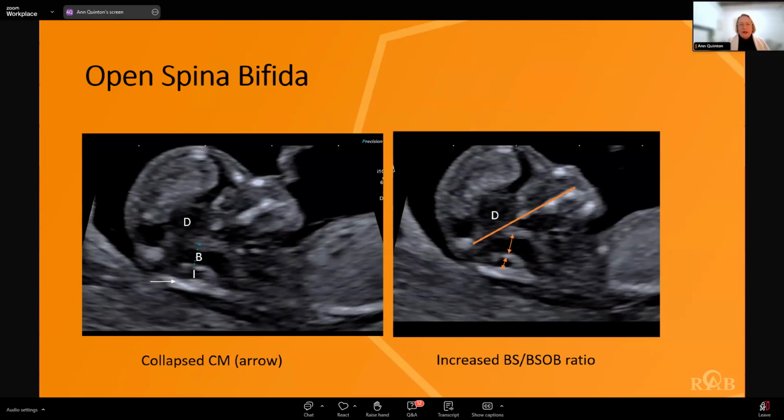We've started trying to scan all our first trimester fetal brains at 13 weeks and 13 and a half weeks. That's because we can get maximum information from the fetus. So we can get a really clear anomaly scan of almost the entire fetus. We can see the heart well, you see the brain well. We're doing preeclampsia screening, so we're doing the uterine arteries.